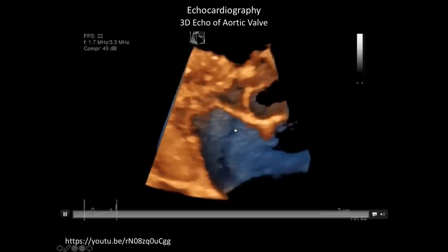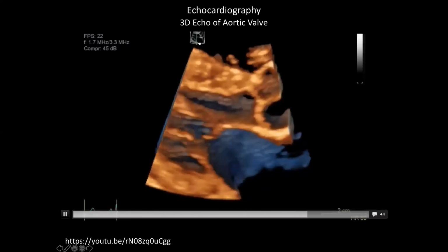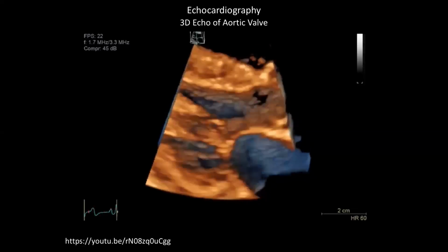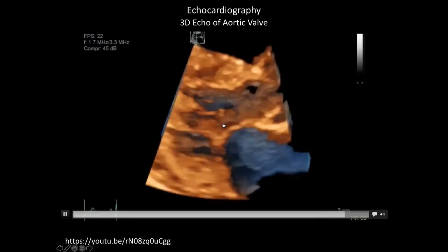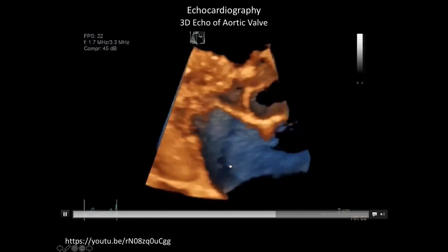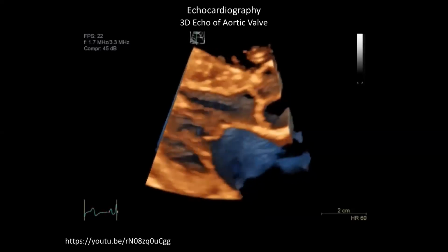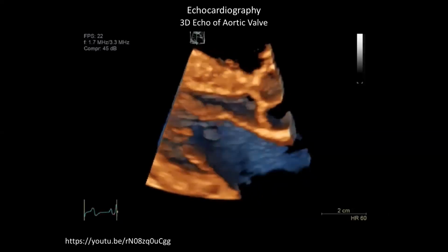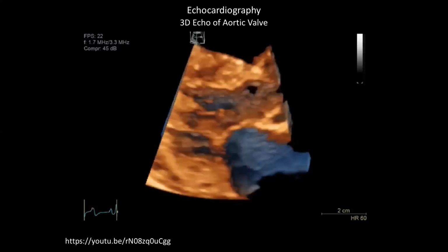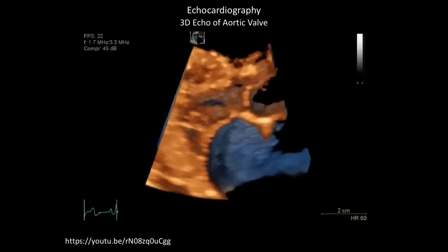So, you know, this is transparent because on the echo, it just doesn't have any signal. There's not a lot to reflect off there unless you did Doppler, right? And so you can render these up so they look pretty nice. The other thing is, you want to look at them in 3D because if they have some weird oblique shape and you're going to put a new valve in this person, you want to measure that geometry, right? To pick the right valve off the shelf, essentially.